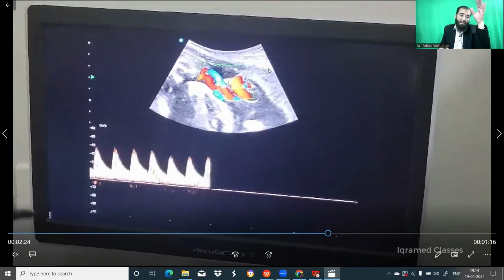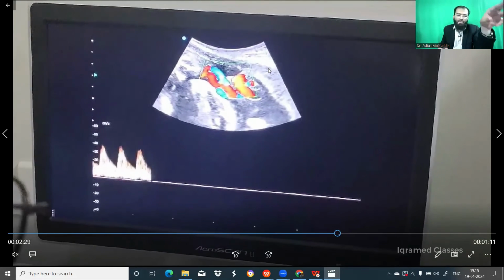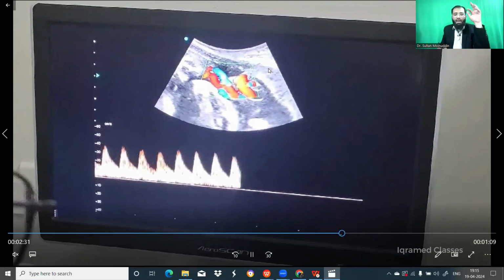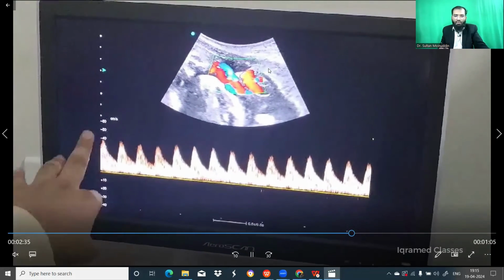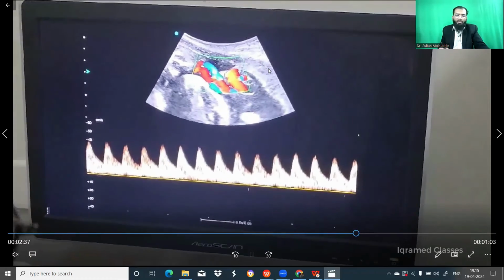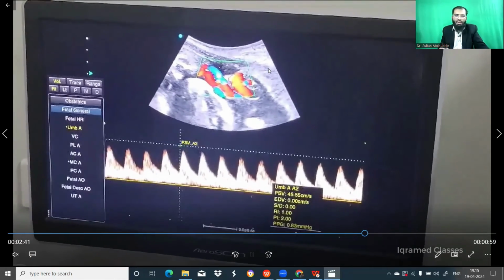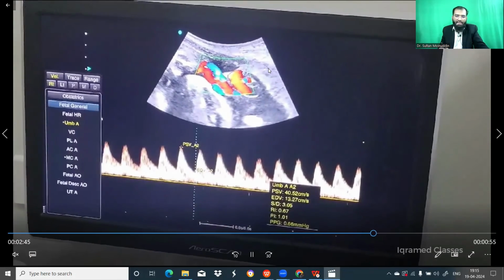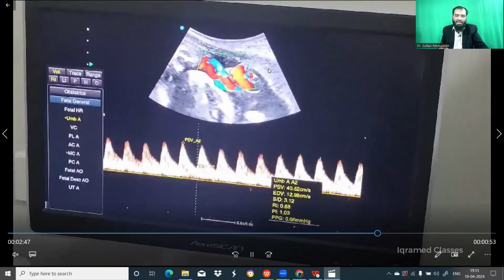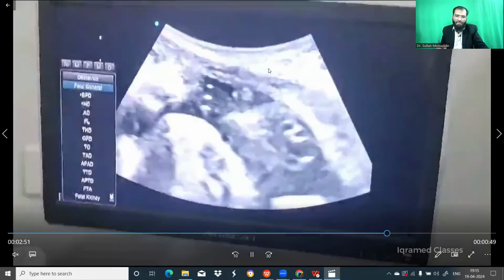There is an invert key which is present on your keyboard, or the up and down key, U/D. So if you press on that, the waveform becomes upright. So now this is a very good waveform which you have got. Now one more important thing here, this is still crowded. Although it is good, this is still crowded. The measurements would go PSV to EDV like this, and as you put your cursors over PSV and EDV, the machine would automatically calculate the various values.